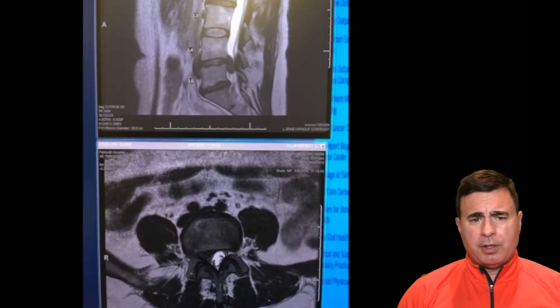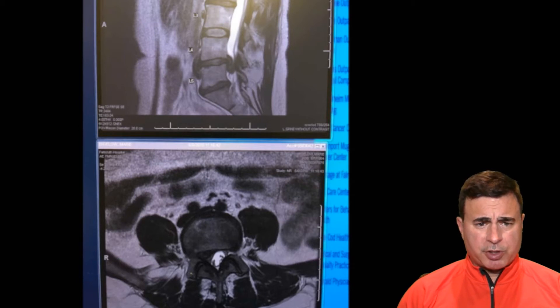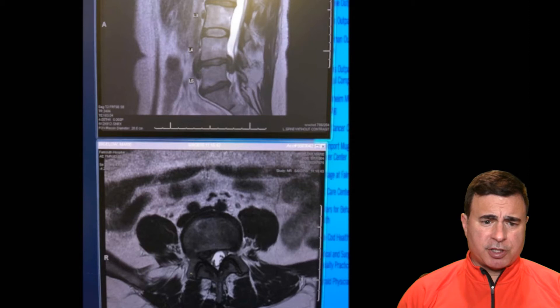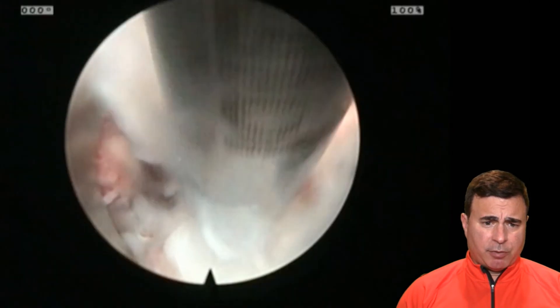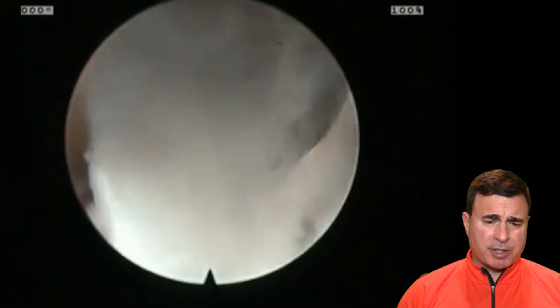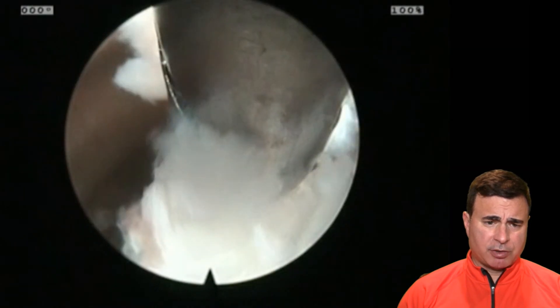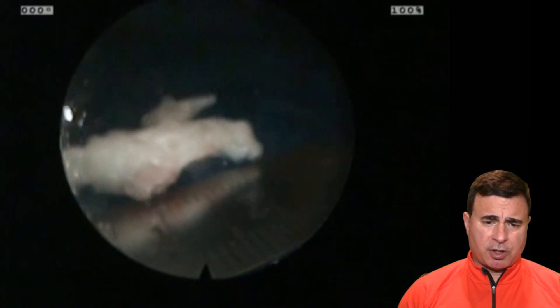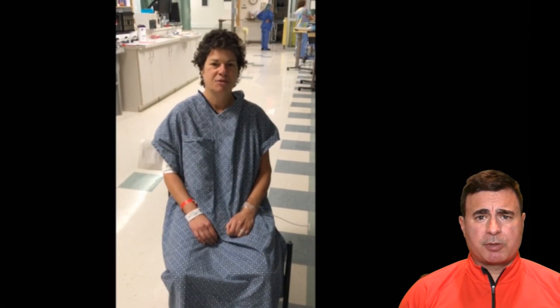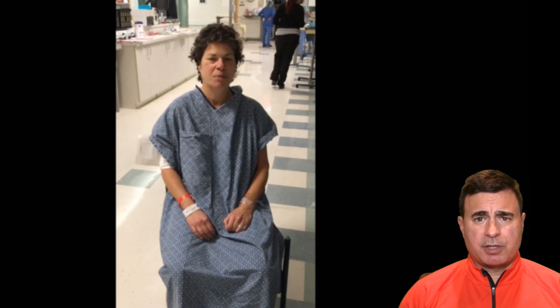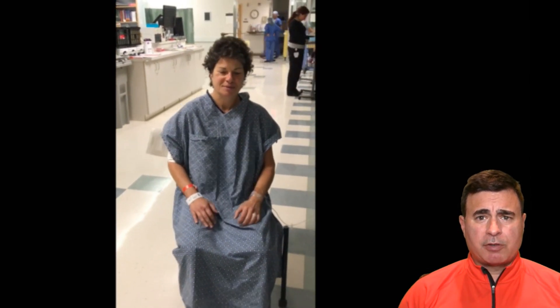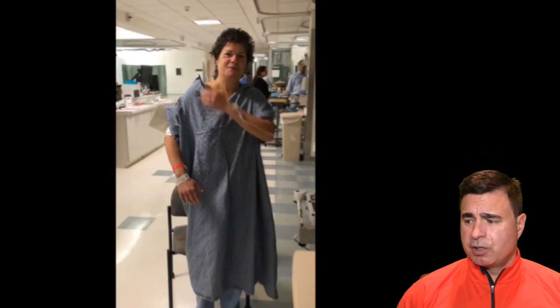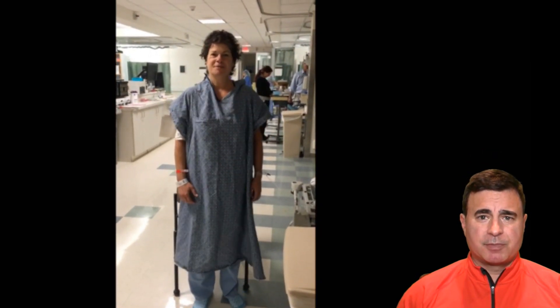When it all comes together, this can be a very rewarding procedure. In this example, this is a very large extruded fragment at L4-5 — the patient had a foot drop. The fragment itself was so large that I had to remove the endoscope and the pituitary all as one unit because it just wouldn't fit through the endoscope. And here is a two-centimeter fragment. I think you're going to find that you're going to be able to incorporate this procedure into the vast majority of the discectomies that you perform. I really look forward to teaching you how to perform this procedure when we get into the cadaver lab. Look forward to seeing you soon.